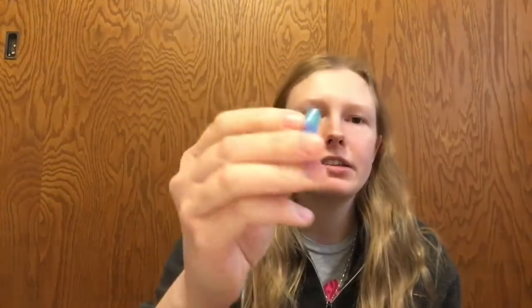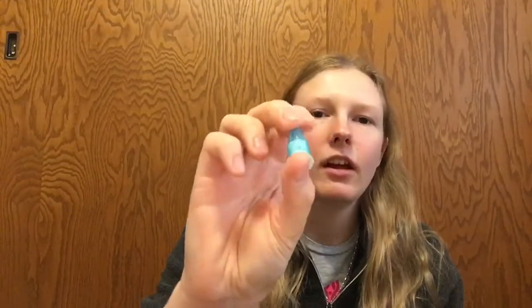Nice thing about these is you really don't have to worry about throwing away a ton of syringe garbage. The only thing you're really disposing of in a biohazard container is the needle, which is a clean needle, but you place it on top of that and you just change the needle out, which I think is kind of nicer on the environment, or nicer on the places that have to properly dispose of all the biohazard stuff.